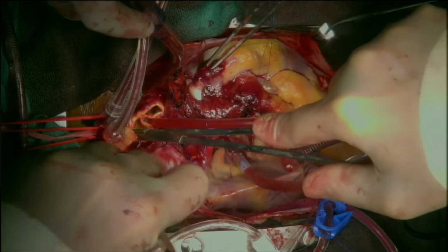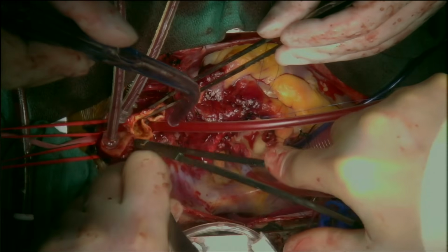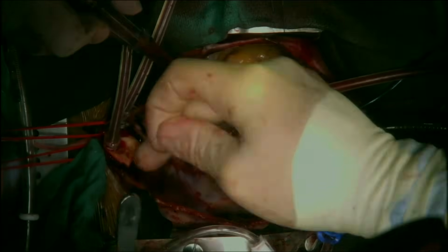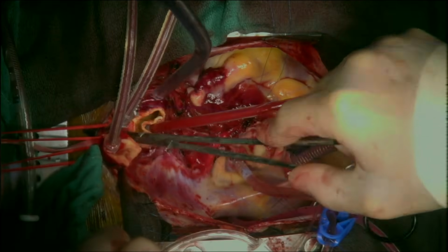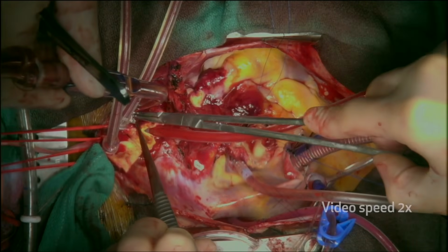The left subclavian artery was clamped. There was a large tear noted in the base of the left subclavian artery with significant back bleeding from the false lumen. Given this and the right lower extremity malperfusion, decision was made to perform a total arch replacement with a frozen elephant trunk. The base of the left subclavian artery was oversewed with multiple pledgeted Prolene sutures.